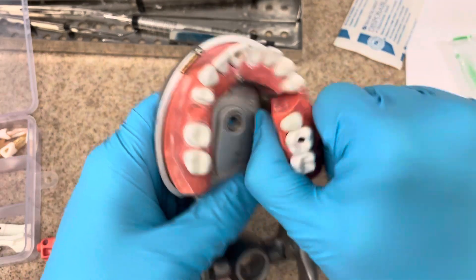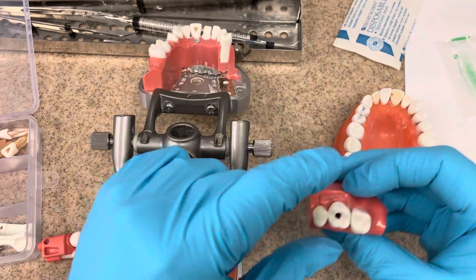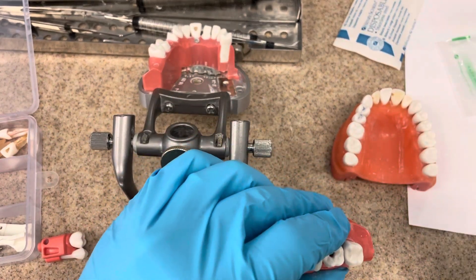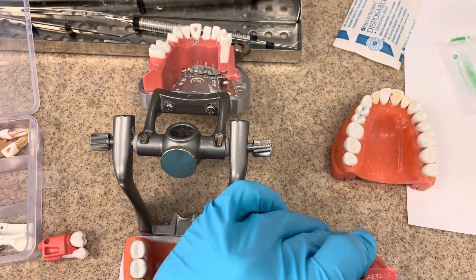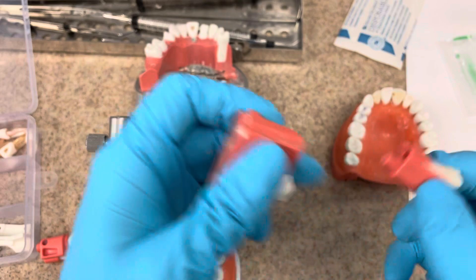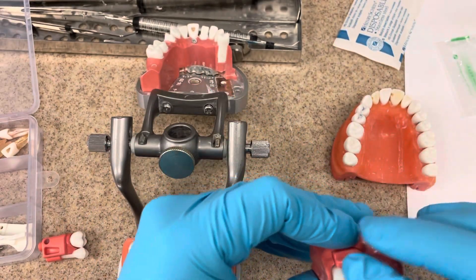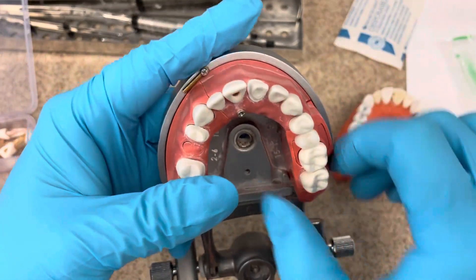These inserts will just pop out just like this. In order to change your endo insert, you'll just take a sharp pointy object, push right here at the base, and it'll push right out. Then you can take your new one, pop it in, and place it back on your Takedon.